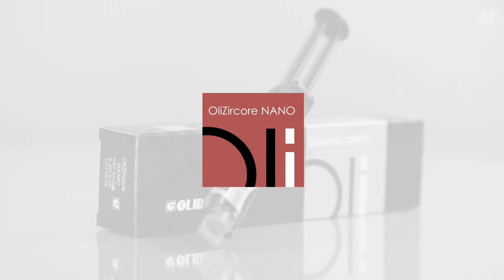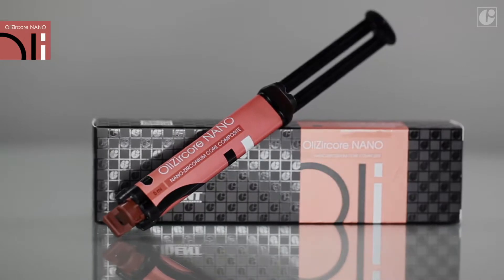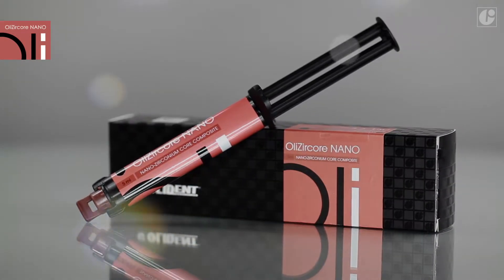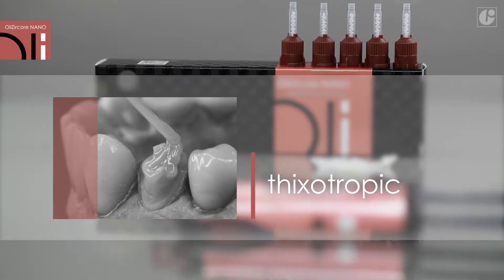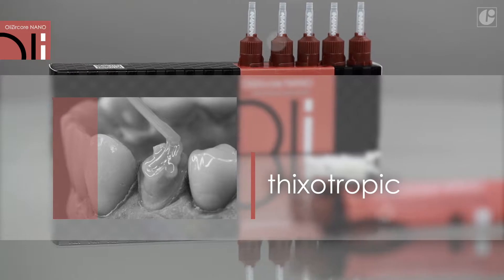OliZircore NANO is a dual curing flowable composite material designed for core buildup and post cementation. Owing to its perfect balance between flowability and stability, OliZircore NANO can be mixed and applied easily. It does not show any resistance when placing a post into a canal, and at the same time does not flow from the preparation field.